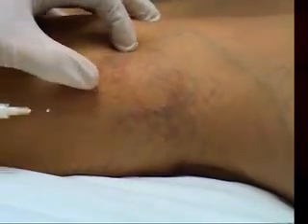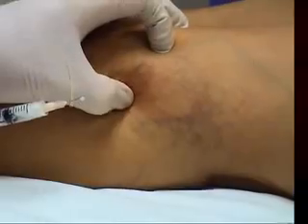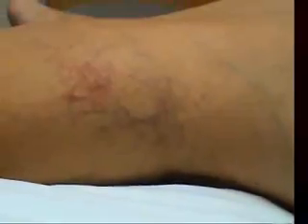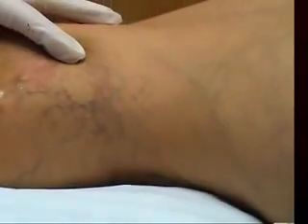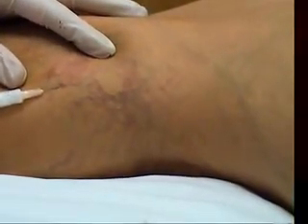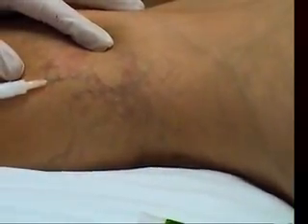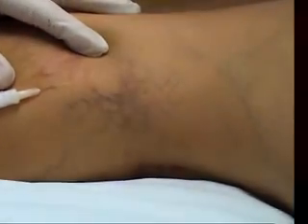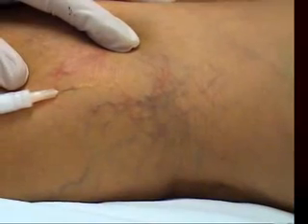And you can see it. There we go. Right at the tip of the needle, you've got a bit of extravasation there, so I'm going to stop there and go over here. I've got more foam I'm going to put in here, so foam on foam here. Oh yes, now look at that. See, that's going nicely again.